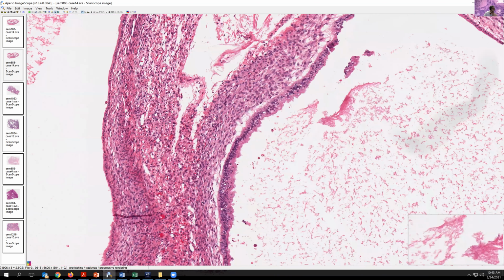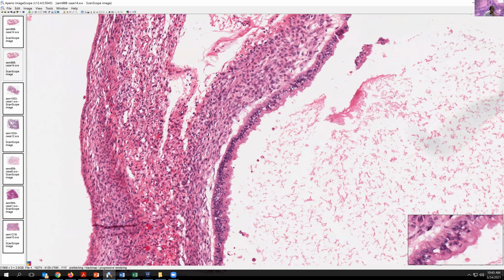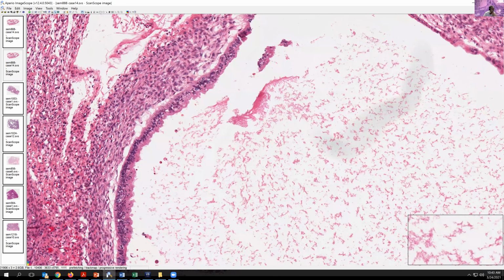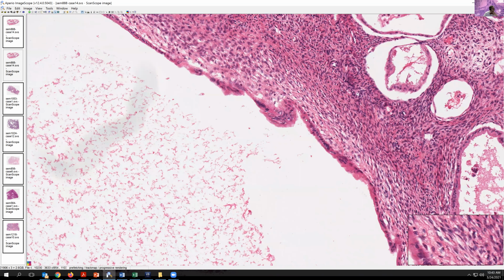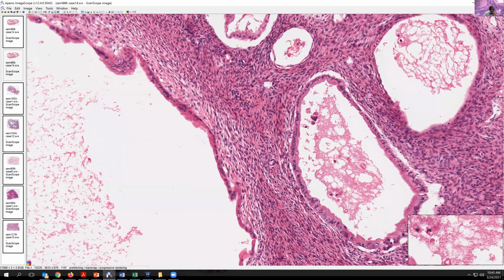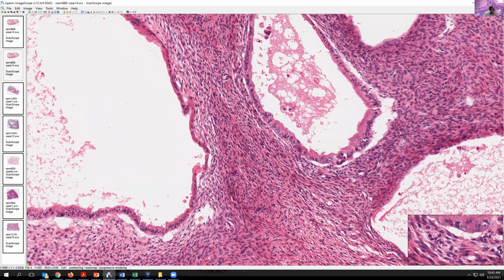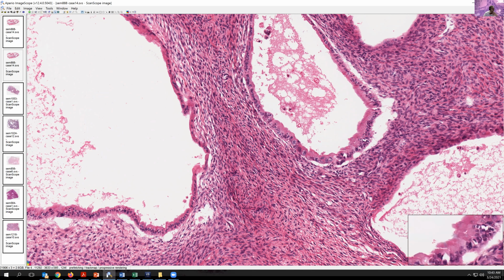So looking at this lesion, we see here on high magnification that we have some atypia of these cells. They're not all totally basal, but they tend to be mostly towards the basal areas. There's a little bit of nuclear atypia, and not a lot of mucinous epithelium, but some. We also notice that the stroma surrounding these lesions is sort of ovarian type fibrotic stroma.